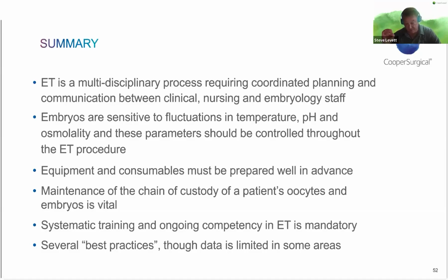Don't forget that at the time of embryo transfer, embryos are sensitive to fluctuations in their environment. So temperature, pH, and osmolality, they need to be controlled. All the equipment, consumables, and everything alongside needs to be of the highest quality, maintained, serviced, etc. We've mentioned on a number of occasions witnessing and chain of custody, of course, in embryo transfer is just as important. Training, as we've shown, is extremely important.